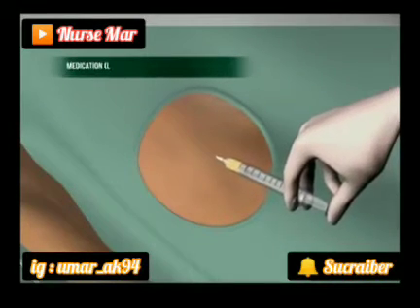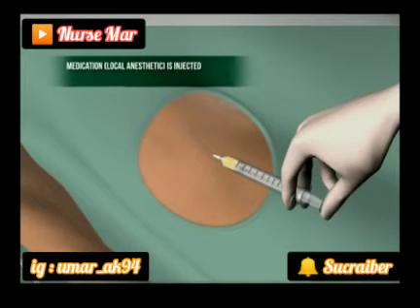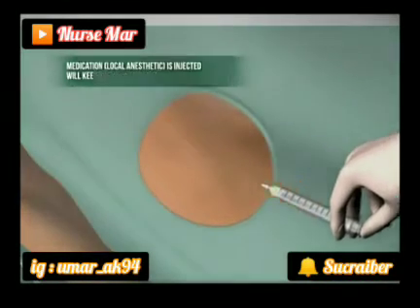A numbing medication, local anesthetic, is injected into the skin over the blood vessel of the thigh or the arm. This may feel like a mild sting, which lasts only a few seconds and will keep the area pain-free.